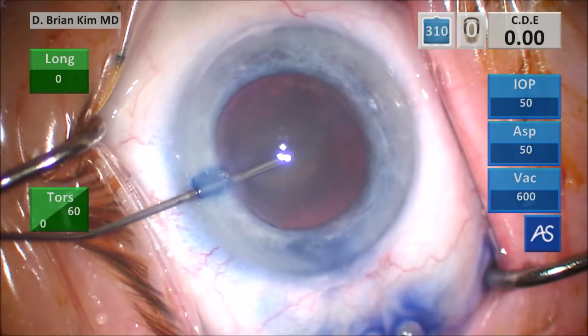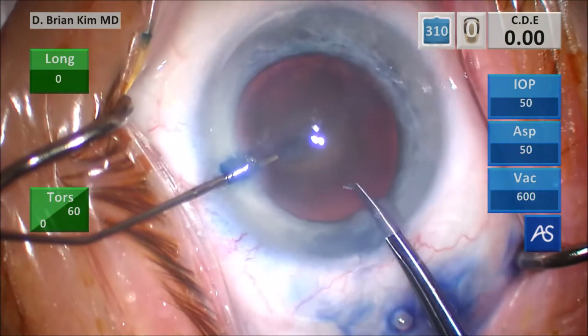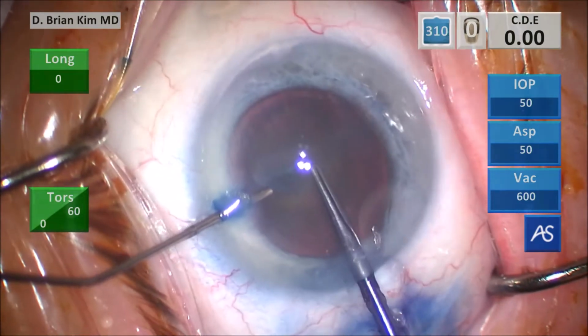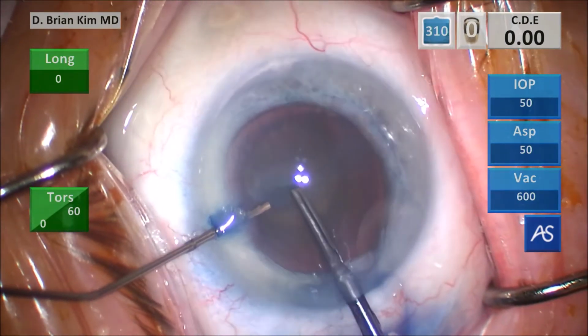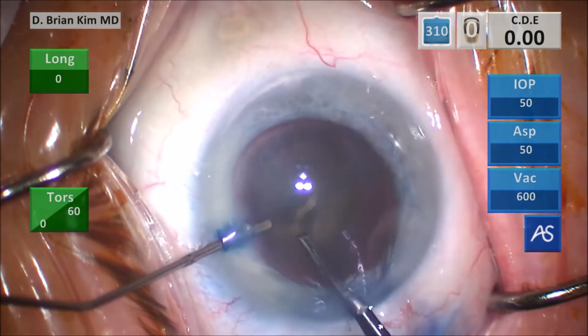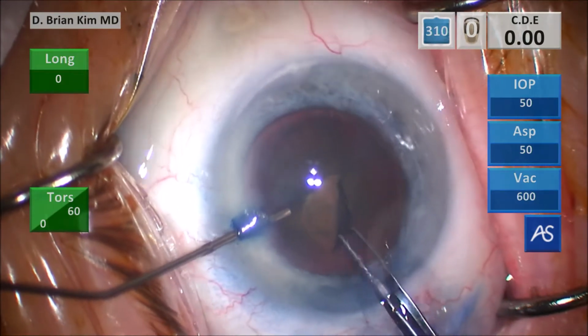I'm going to use that cannula to push more viscoelastic simultaneously as needed during the rhexis. And so that's an important pearl and tip. You can use the cannula with the viscoelastic. Again, you already have the dispersive viscoelastic. Why not just use it? I hold the eye, and this gives me control of the eye, but also allows me to push more viscoelastic.